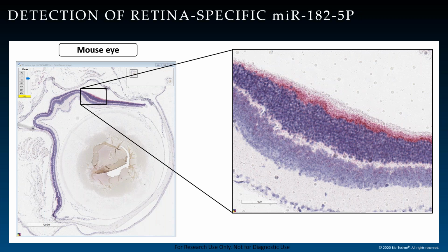So as you can see, microRNA 182 can be highly detected in this particular tissue. And miR-182 has multiple roles within the retina, including cone receptor and visual function, and also deletion of this particular microRNA in mouse models results in retinal dysfunction in mice, showing that this particular microRNA is very important for the development of the cones and the rods within this outer nuclear layer.